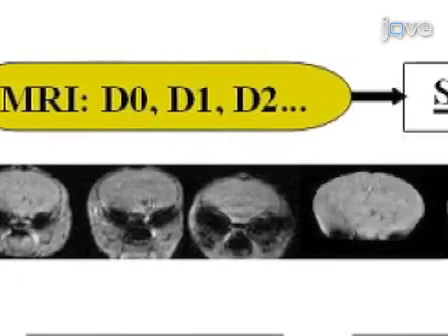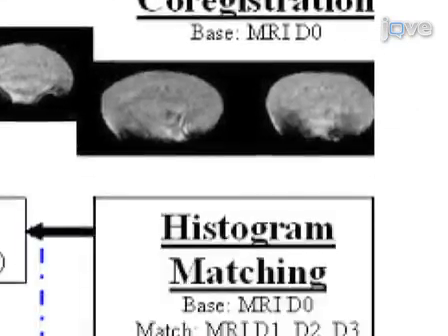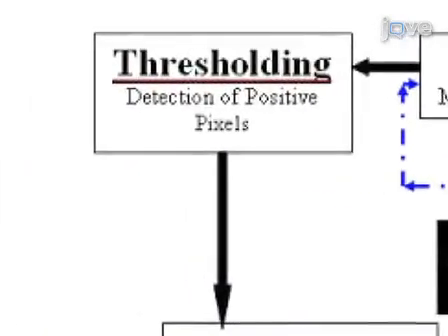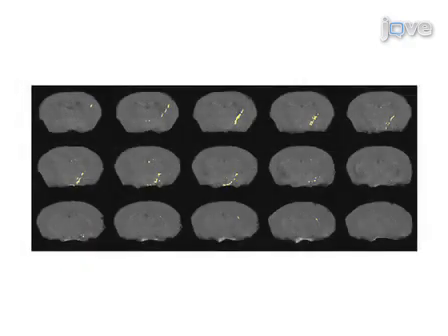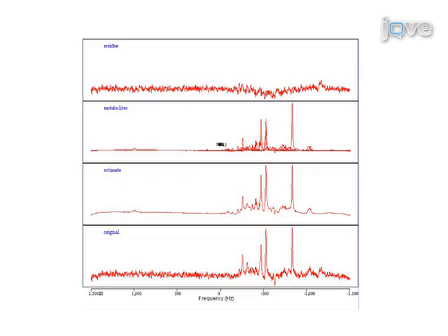The third step of the procedure is to perform end-point histological analysis of nanoparticle biodistribution and cellular alterations. Co-registration of the imaging results is done with histology. The final step of the procedure is to quantify and display the biodistribution of the nanoparticles, determine spectroscopic abnormalities, and assess diffusion tensor abnormalities as a function of time after placement of cell injection.